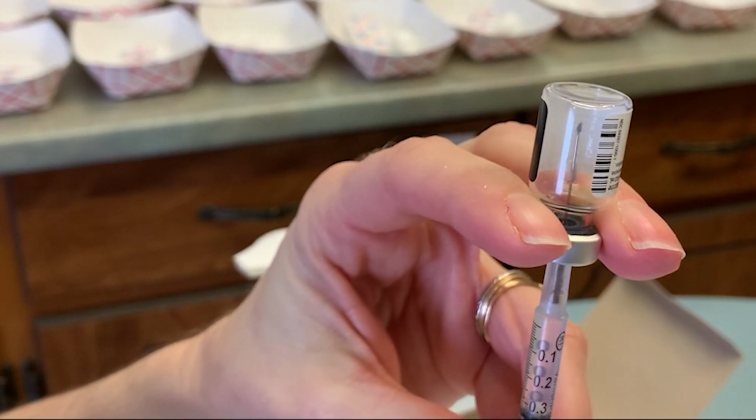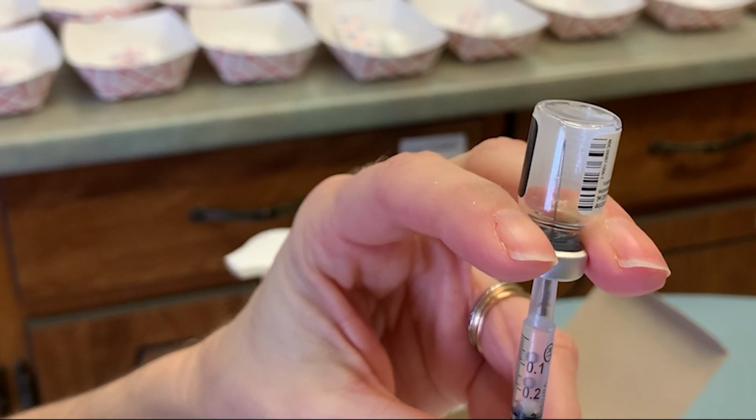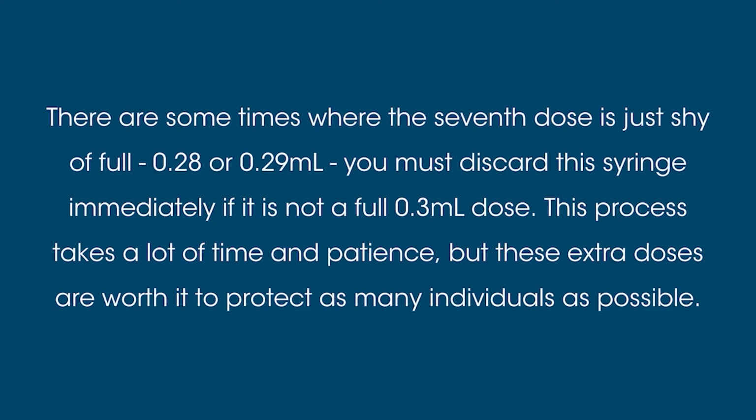Please note that accuracy is of utmost importance. You must never add more than 1.8 mL of diluent. Every dose must be exactly 0.3 mL with the vaccine right to the bevel of the needle. There are sometimes where that 7th dose is just shy of full, 0.28 or even 0.29 mL. You must discard this syringe immediately if it is not a full 0.3 mL dose.